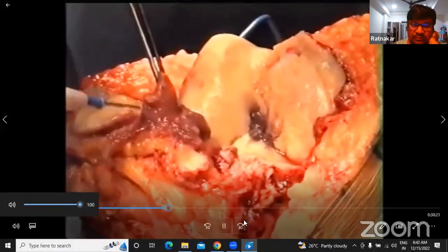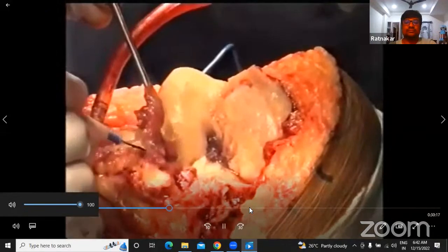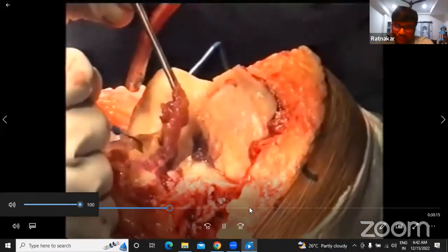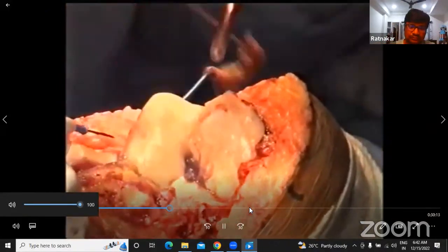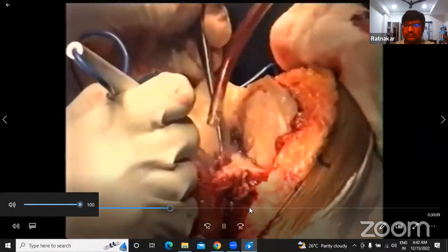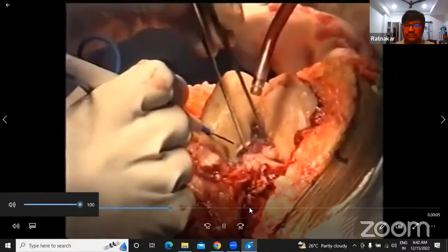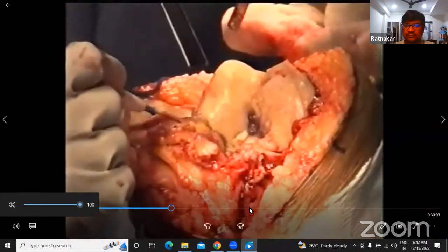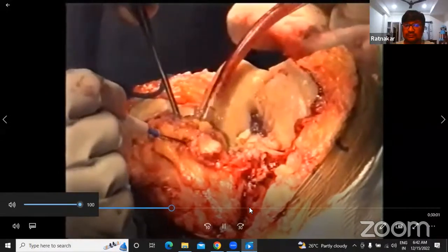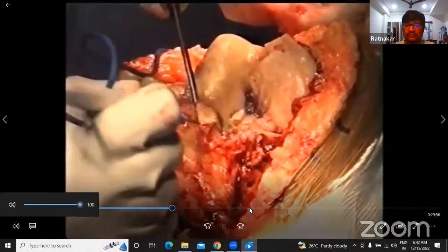Infrapatellar fat pad should be taken off as much as possible to increase the accessibility of the joint. But one important caution is sometimes when you try to do this, the tendon is right beneath that. Sometimes you might cut that. So be careful.